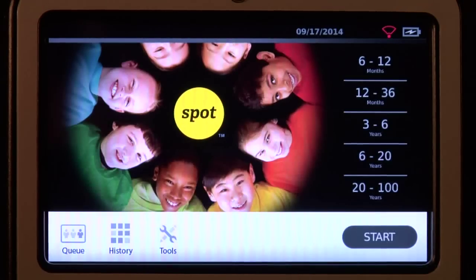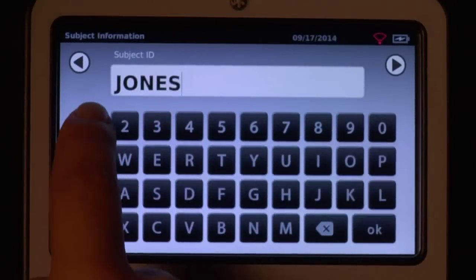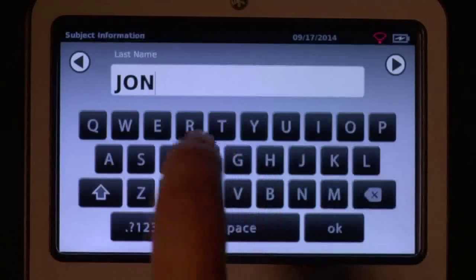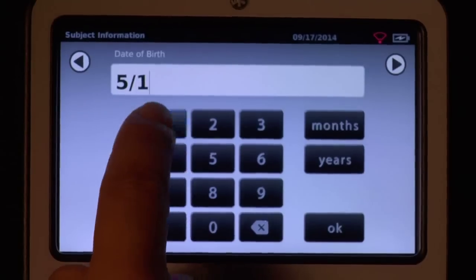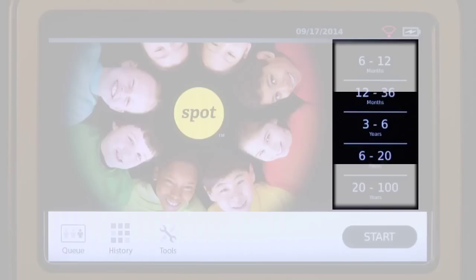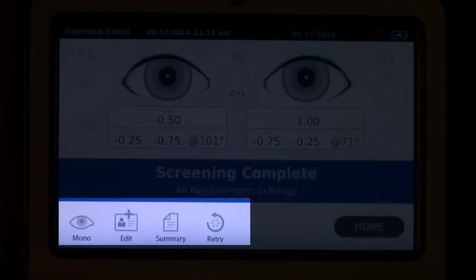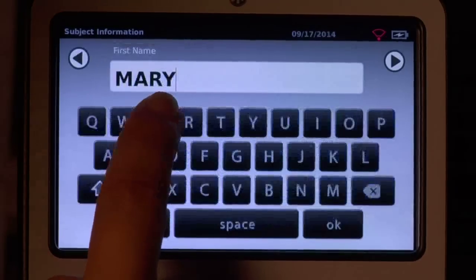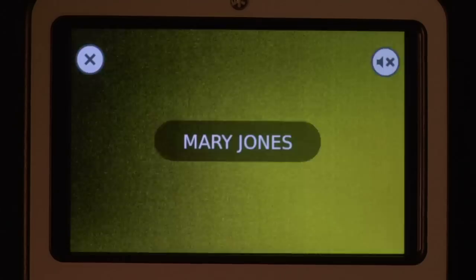To begin the data entry and screening process, select the Start button. This will allow you to enter subject information such as ID, first and last name, gender, and date of birth or age. The subject's age or age range is required. To begin instant screening with no personal subject data, select the age range of the subject from the home screen. Be sure to confirm all data is correct on the subject information screen. You can modify information by touching the field you wish to change. Select Go to begin the screening process.